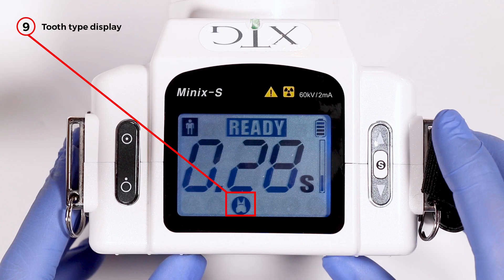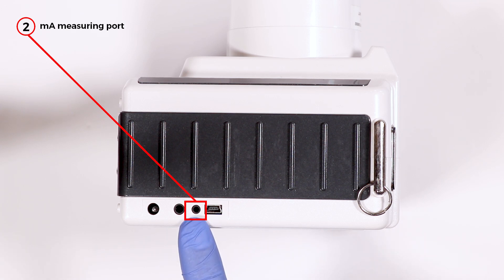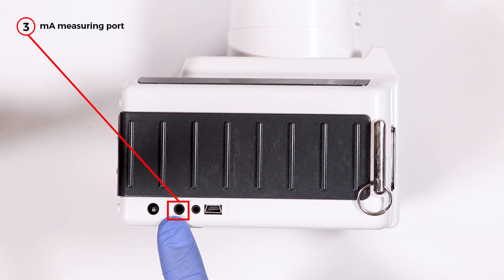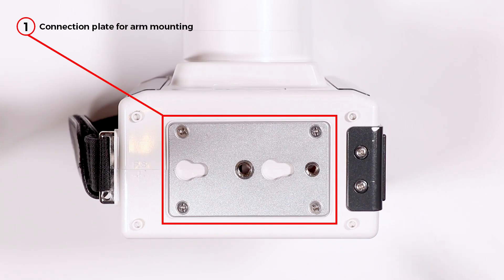Seven is the up-down exposure time control button. Eight is exposure time/error display. Number nine is the tooth type display. On the side view of XTG, the number one position is your backup port. Two is the MA measuring port. Three is a hand switch connection port. And most importantly, four is your charger connection port — that's where you'll plug in and charge the unit.